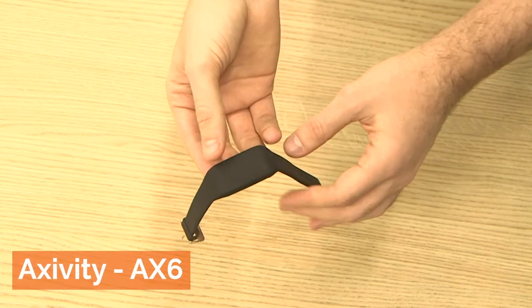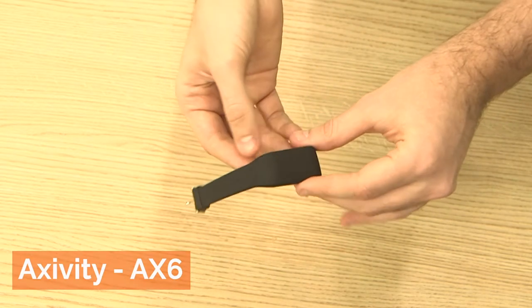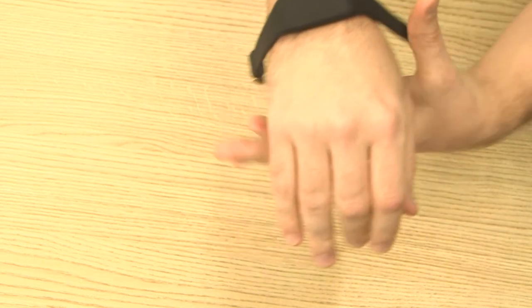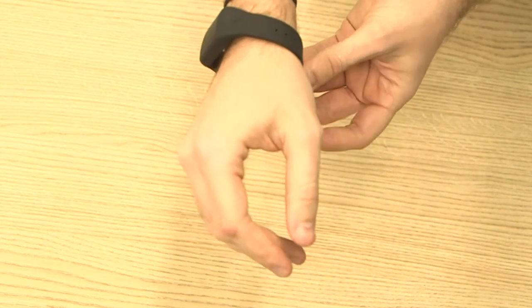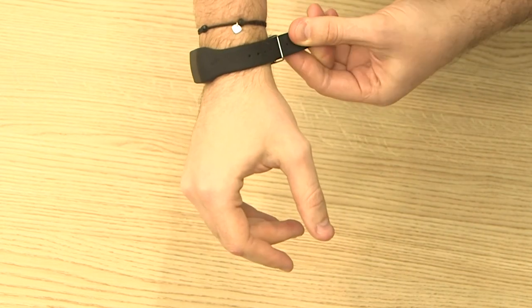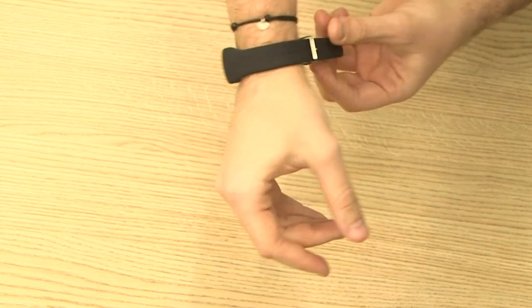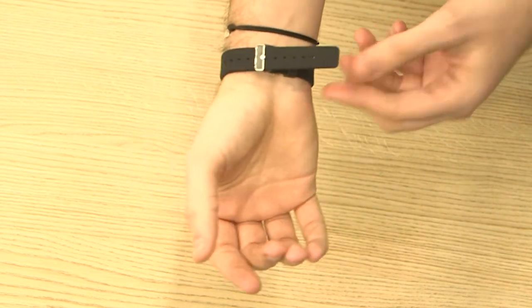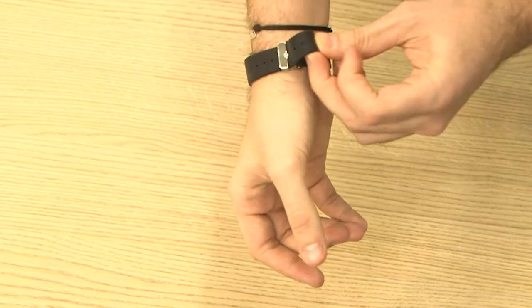Here we have Axivity's AX6 device. It's a wrist-worn band for movement tracking. You just place it on your wrist and strap it in. The strap accommodates a large range of wrist sizes. It comes in two colors, black as we see here, but also light blue. It's made from silicone, and because of that it's waterproof.